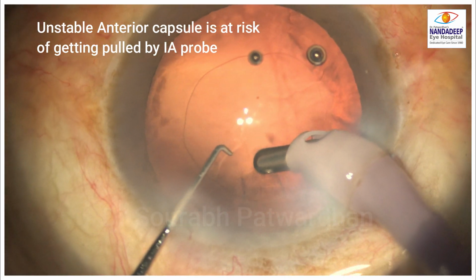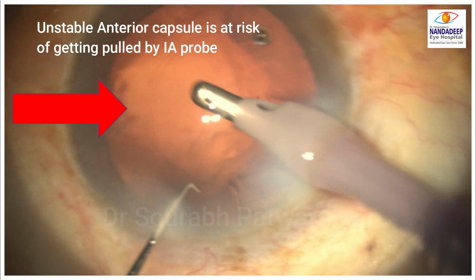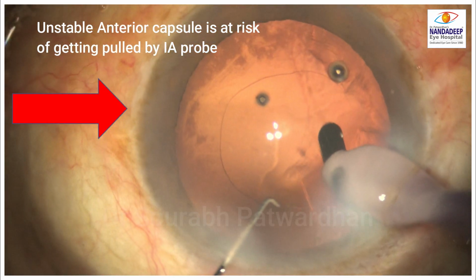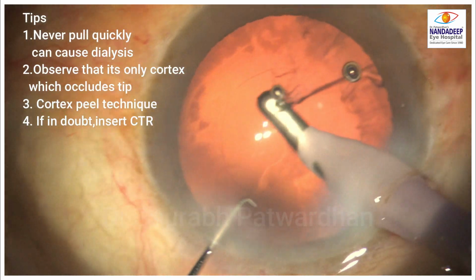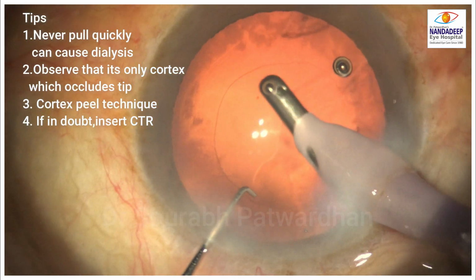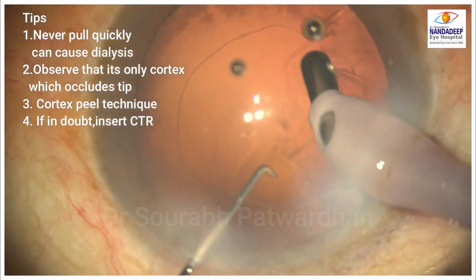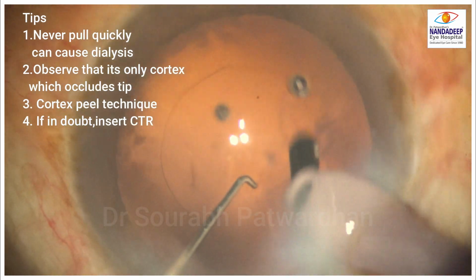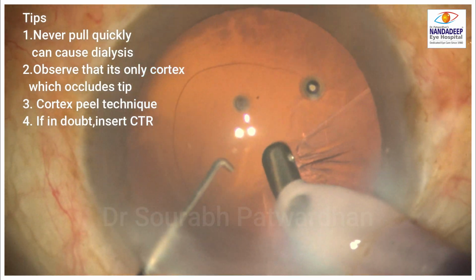and there is always a high risk that the anterior capsule may be pulled during cortex aspiration. So you have to be extra careful here. Make sure you are holding the cortex and not the capsule. Use a slow cortex peeling technique, and in case of severe movement of the anterior capsular rim, you can use a CTR.